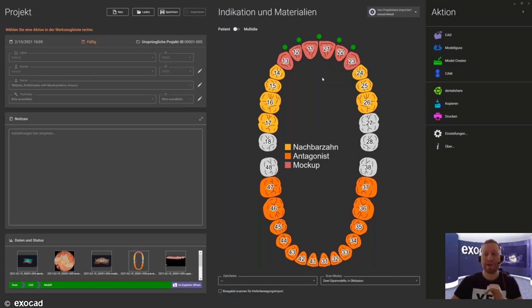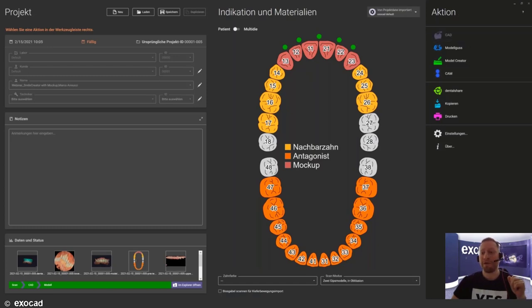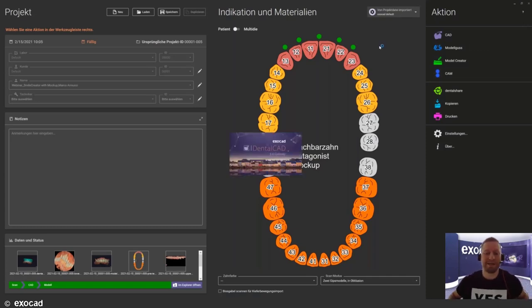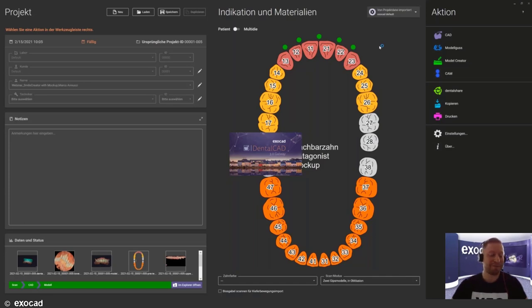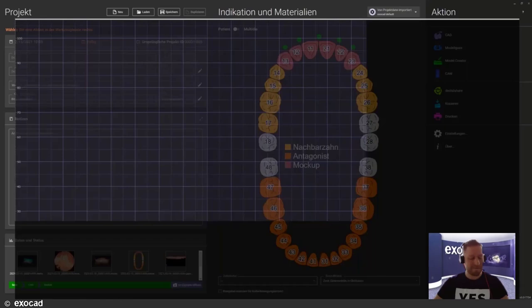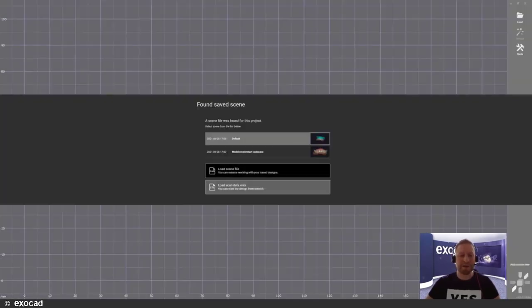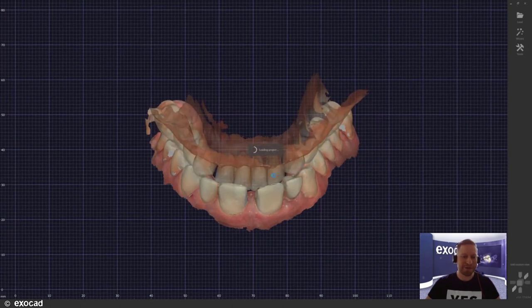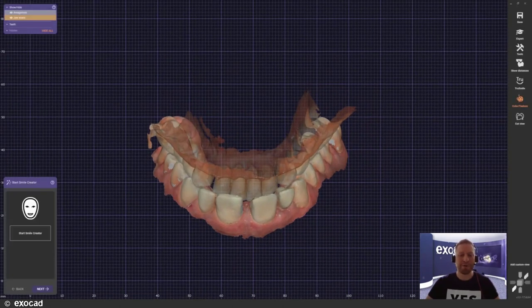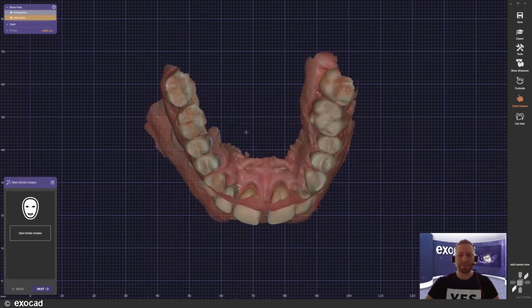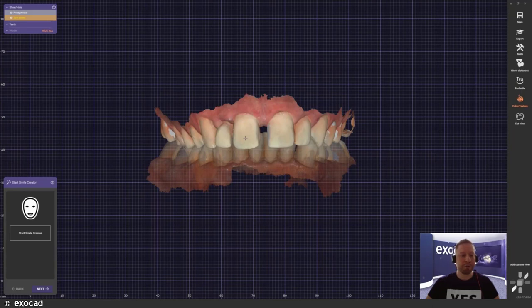We'll give you a brief glance of what we have in store for next week's model creator session. So with no further ado, let's jump right into the case. Here is DentalCAD 3.0 Galway, engine build 7754. It is a very outstanding software that will make designing so much easier and more enjoyable.